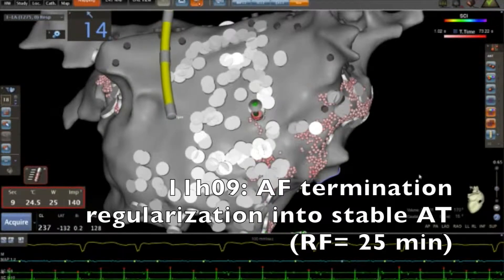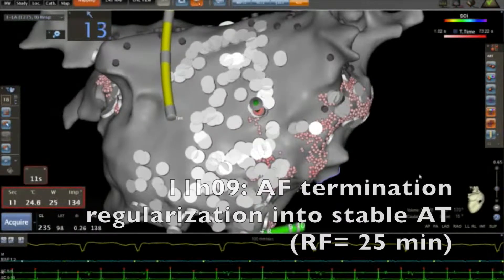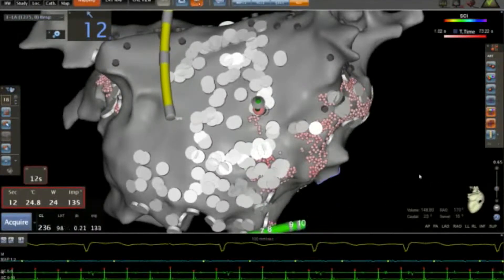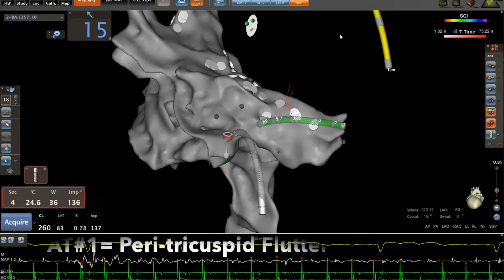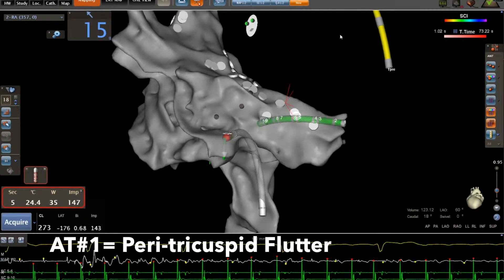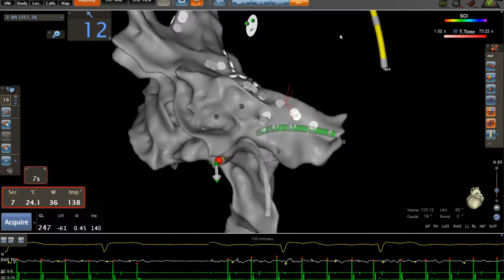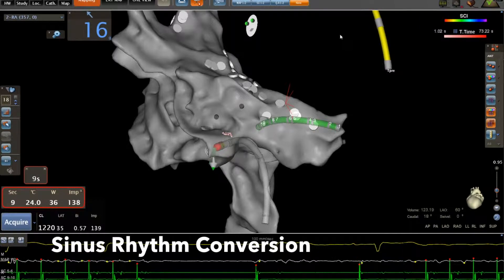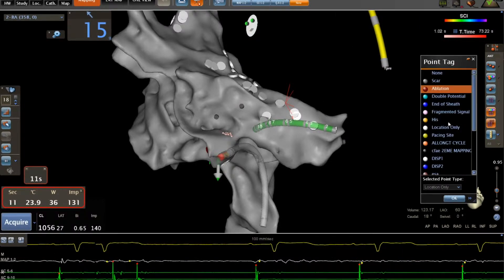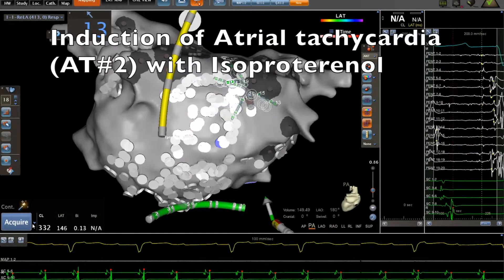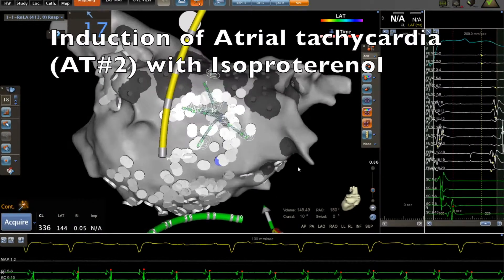After 25 minutes of radiofrequency, we organized AFib into a stable tachycardia. This atrial tachycardia was a peri-tricuspid flutter that we ablated and restored sinus rhythm. Then we induced another stable tachycardia.